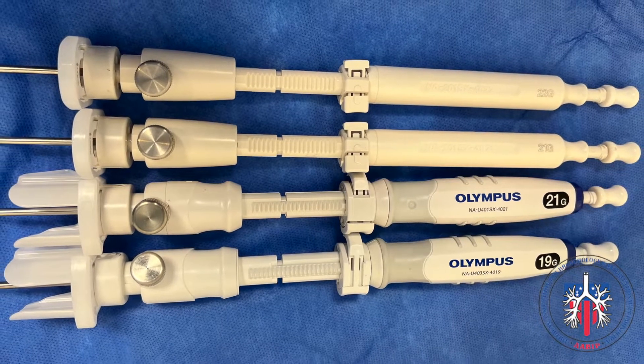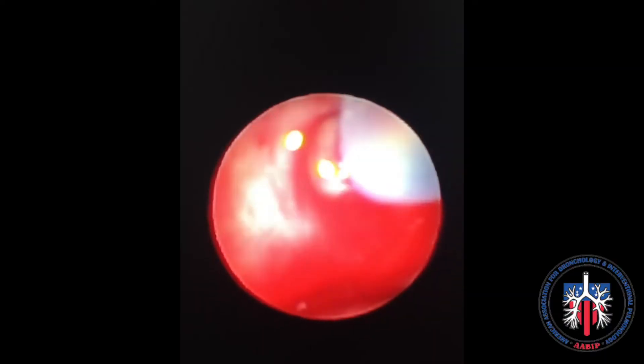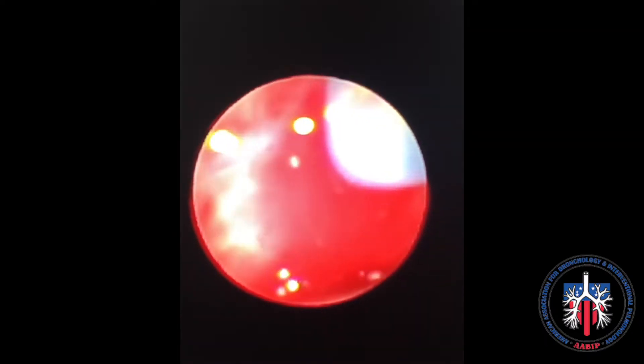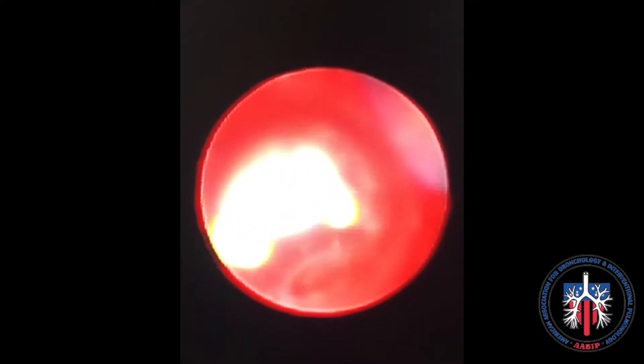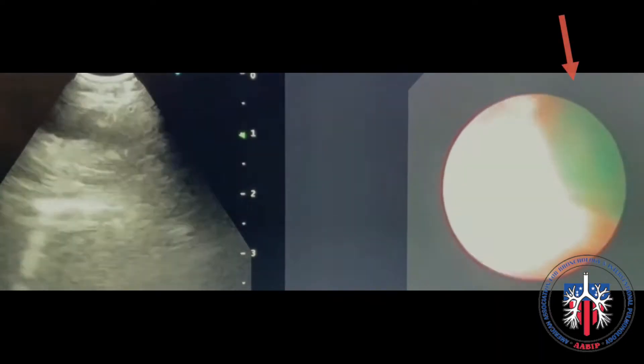Placed side by side, you will notice the difference in locking mechanism at the base. VisiShot 1 has an opaque clear sheet. VisiShot 2 has a green sheet, seen here on bronchoscopic view.